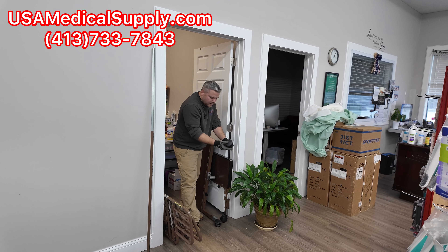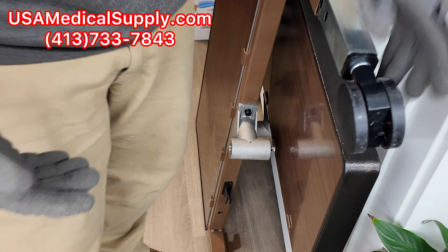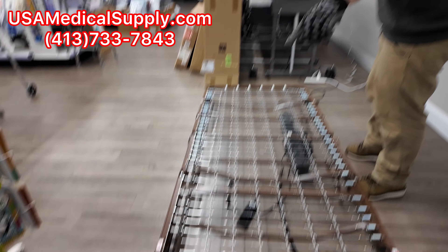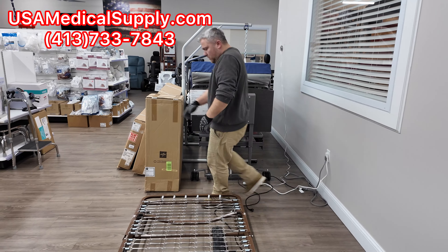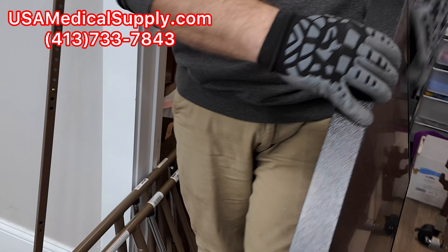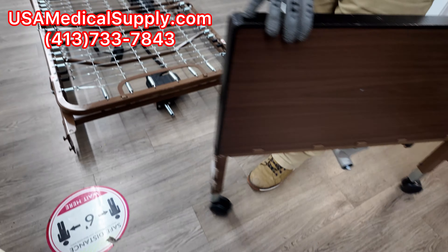Now we're ready to put the casters on. Sometimes they come separate in a bag — it's simple: the ring goes in like that. Two of the four casters have brakes, two don't. You can arrange them however you think best. Sometimes we put them diagonally — a brake on one corner and another brake on the opposite corner. If the bed will be placed where you can't access one side, put both brakes on the accessible side so you can always lock it. The taller board is the headboard.